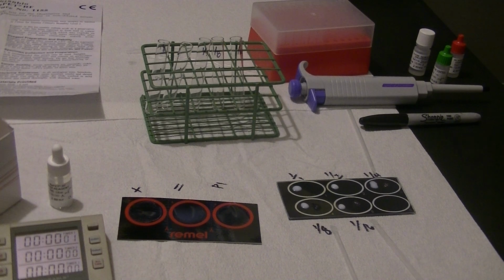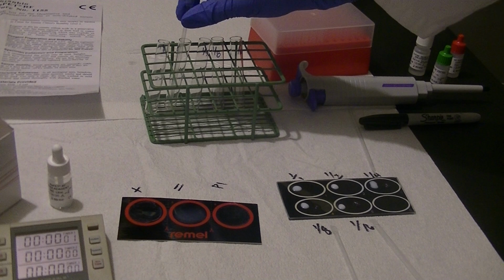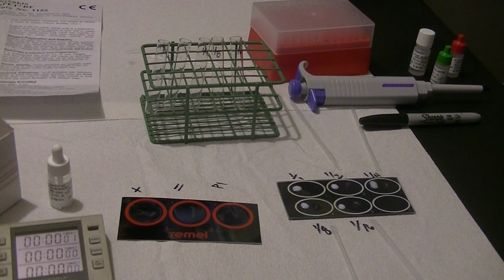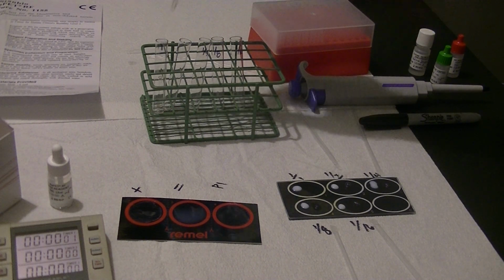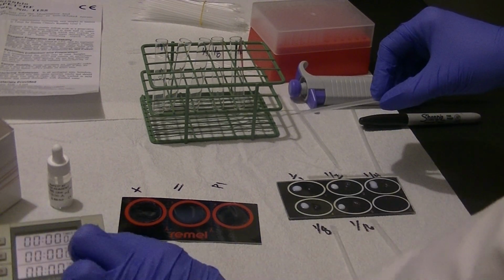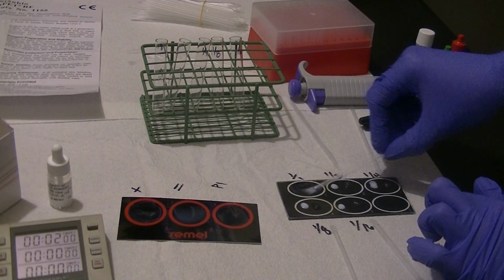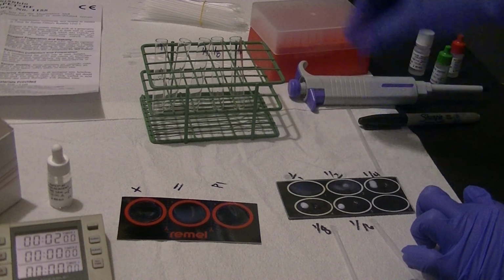and I'm actually placing my dispenser right next to the circle where I added the sample so that I can use the stirring end to mix the 2 drops in the next step. Okay. So lastly, I'm going to mix my latex drop with my patient sample in each of these reaction circles.